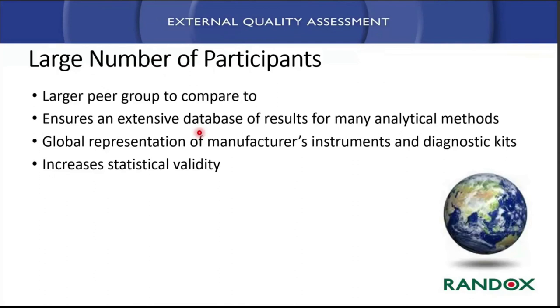So basically, we look at the instruments, and we can look at the performance of your instruments within your country. But that's very often very small numbers. So we look at it on a much larger scale. We look at how those instruments perform globally, which gives you more confidence in the information that's been provided. It increases your statistical validity.